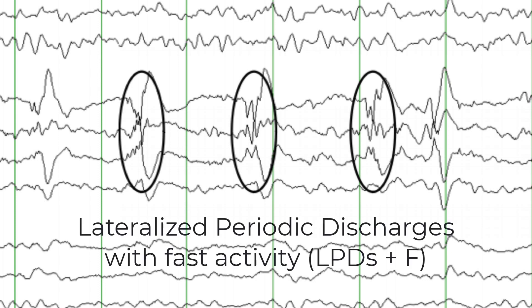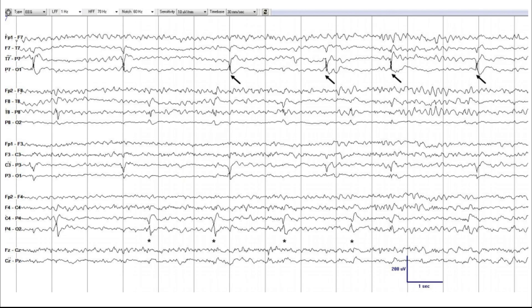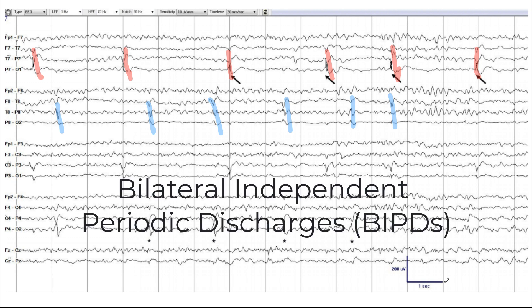Therefore we call those LPDs — lateralized periodic discharges — plus F for fast activity. In the next example, indicated by arrows, periodic discharges occur in the left posterior head region, and independently in the right hemisphere in the posterior head region on that side. Therefore we call these bilateral independent periodic discharges, or BIPDs, as there is an inter-discharge interval in each case and the two sets of discharges are independent of each other.